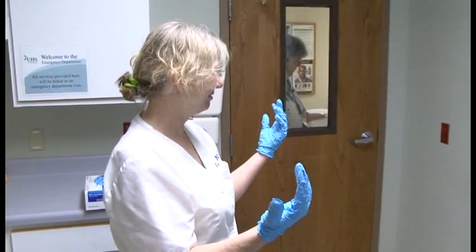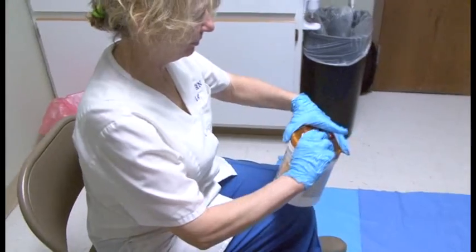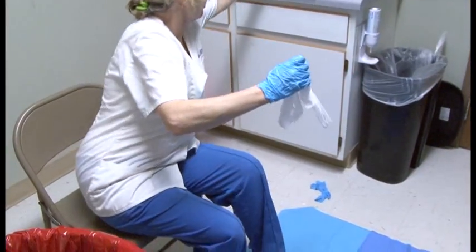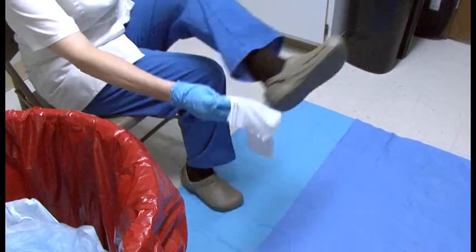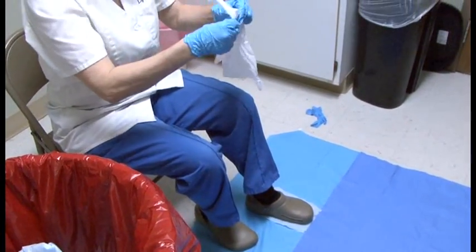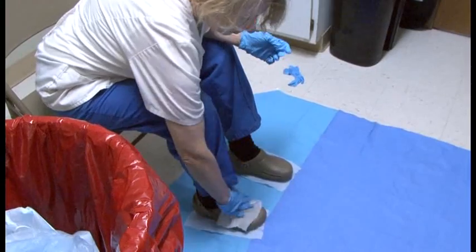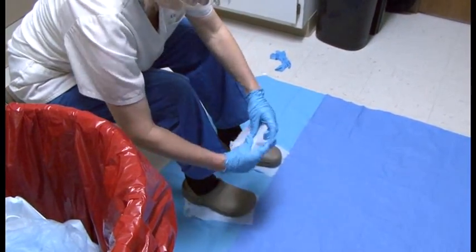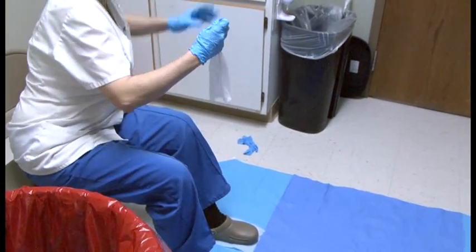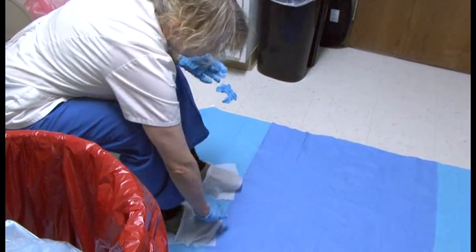Now Lynn bleaches her shoes. She takes two bleach wipes and sets them flat on the floor, then places her Crocs on them. While standing on the bleach wipes, she wipes the outer top and back of her Crocs. The wet time is four minutes, so the Crocs must remain wet for four minutes. She can set the used wipes on top of the Crocs afterward, and the observer times her and lets her know when four minutes are up.